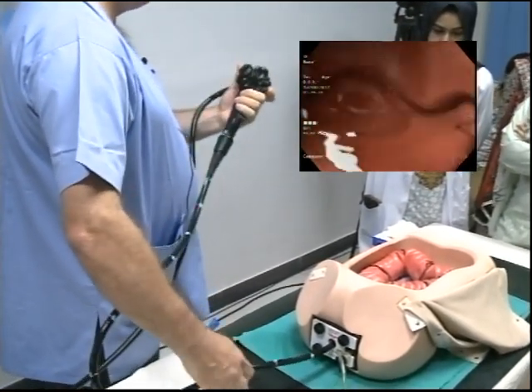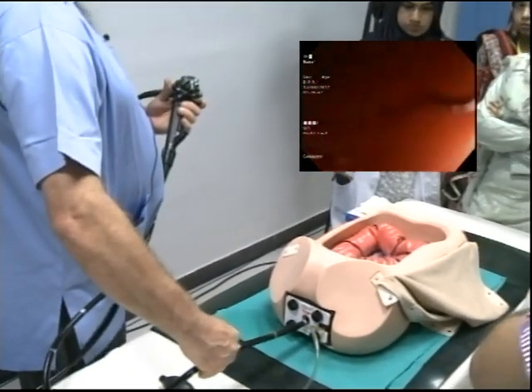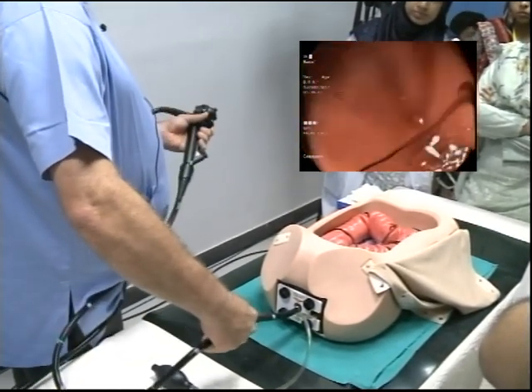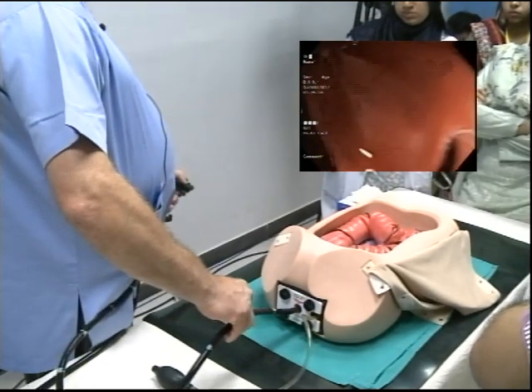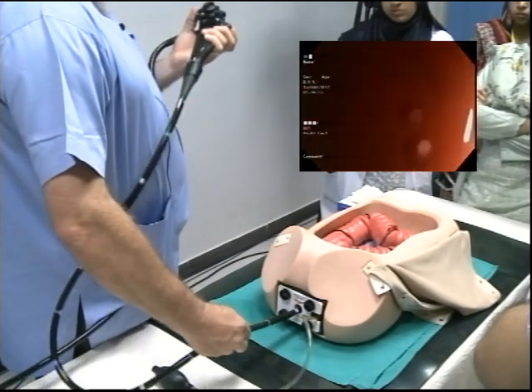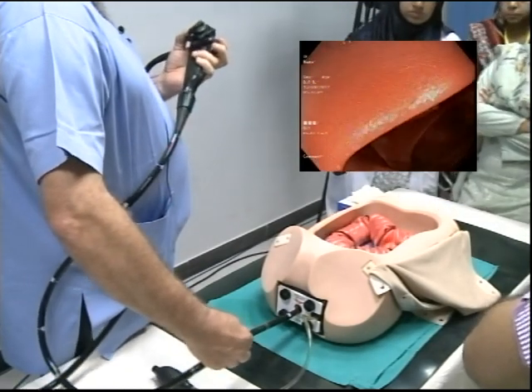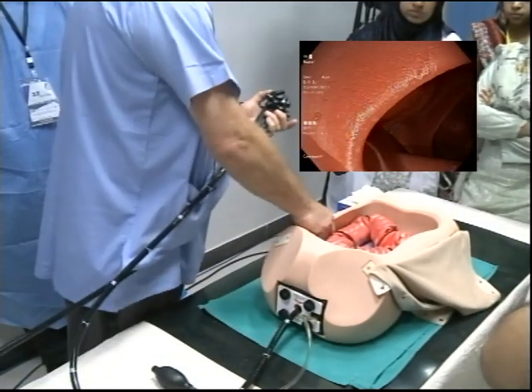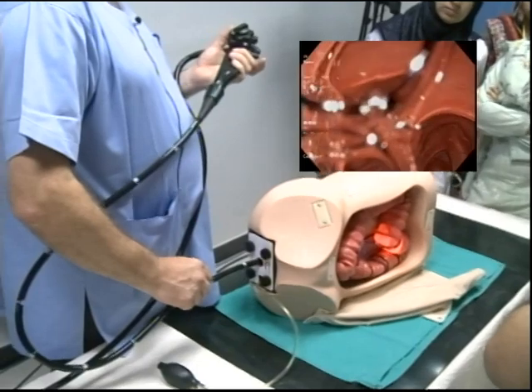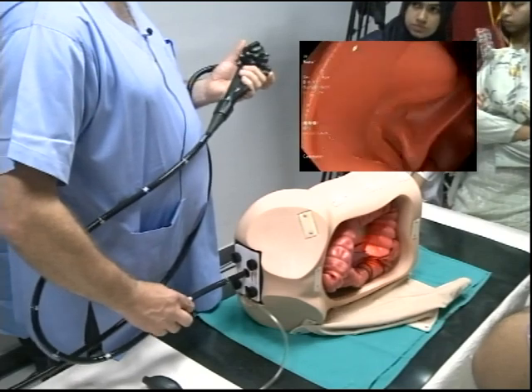Anti-clockwise, because I want it anti-clockwise, big wheel's going forward. Neutralise your little wheel, because you'll always end up catching this silly thing. And now you'll see that it wants to come up. As it comes round, you'll see there, the lumen's come into view. Bring it back to clockwise, and then draw back, and the whole thing will shorten. And then if you want it to be successful, change the position of the patient, draw back again, and then you can go forward. Scope itself will actually advance.